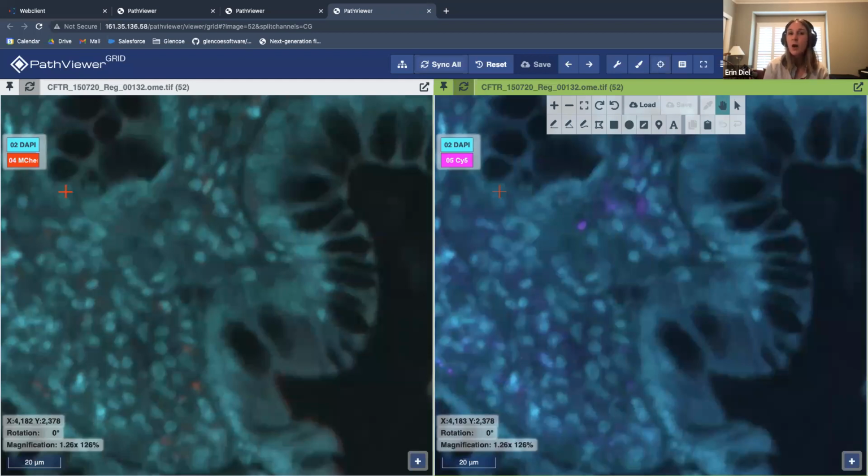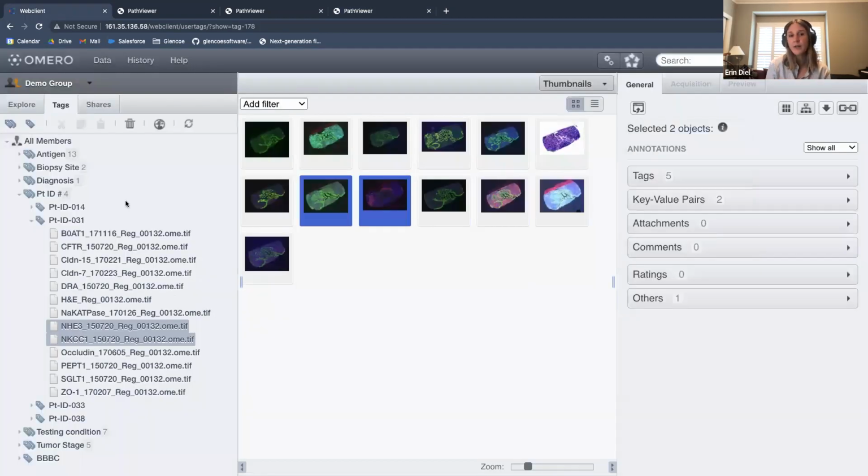And in that session, we're going to talk about the OMERO Cell Profiler connector, where you can run Cell Profiler analysis via the browser, or you can use the traditional Cell Profiler desktop GUI with images that are sitting in OMERO. That will be a deeper dive into how you can perform that Cell Profiler analysis and how you use things like OMERO scripts, which I mentioned earlier. I'll go through what OMERO scripts are and how you interact with them in a little more detail. It'll be in the context of the OMERO Cell Profiler connector, but I'll highlight some of the others that I mentioned here today in terms of importing metadata so that you can see those examples as well.